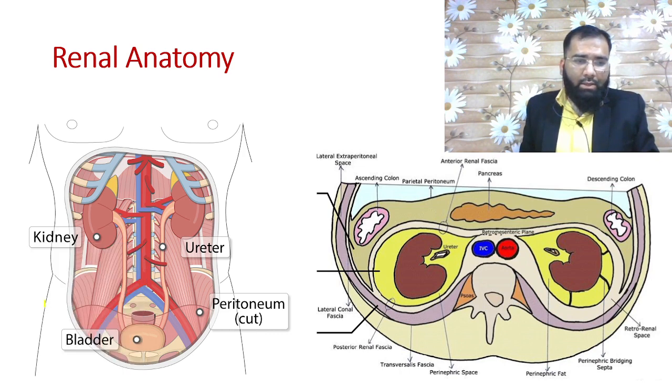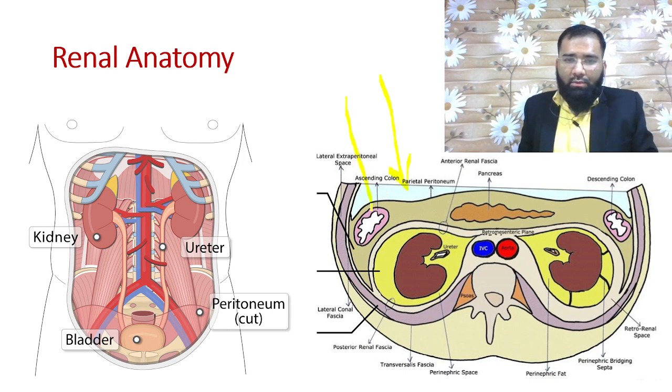I'll take a highlight. Okay. So suppose I'm doing ultrasound and suppose I approach the kidney from anteriorly. So what is going to happen? Suppose I approach it from here. So ultrasound will pass and here comes the colon.